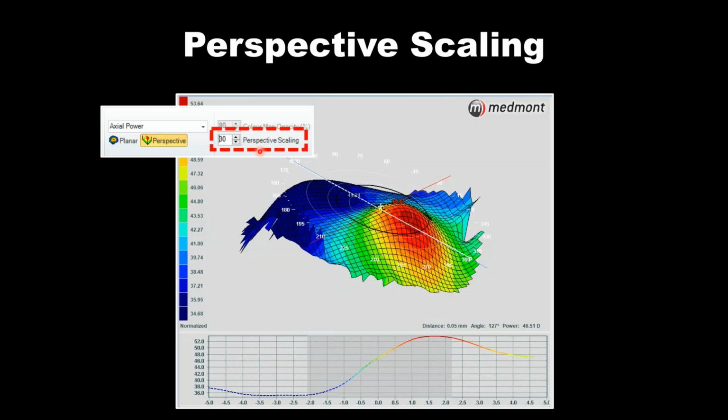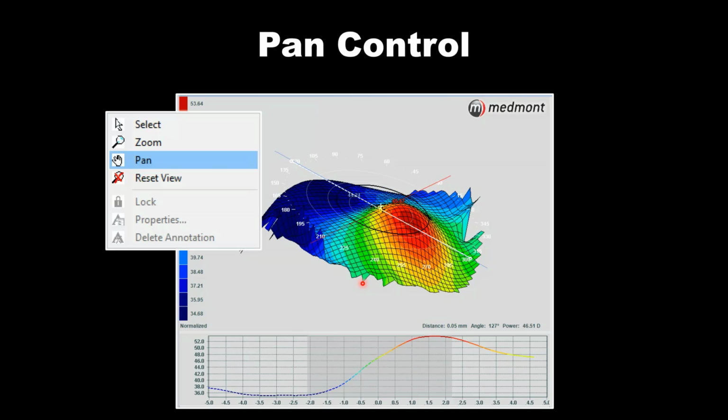So if I increase that to 30, now we're beginning to see how curved that keratoconic eye is inferior and how uncurved it is, how flat it is superior of the apex. So this can be a valuable tool when you're trying to explain the eye shape to a patient. I don't think this has value clinically from the perspective of, is this a diseased eye? Is this an eye that requires a corneal GP or a scleral? I don't think for any of these conversations it's worthwhile, but for patient discussions, I think this has great value.